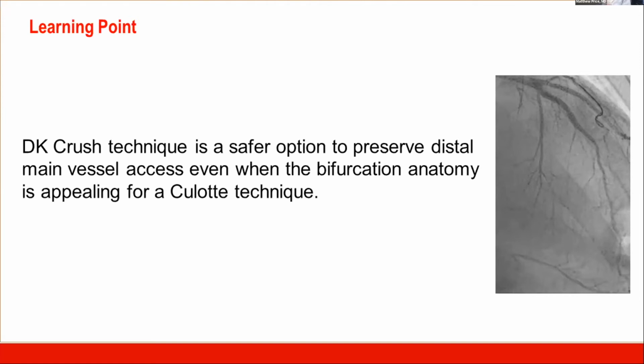Isn't that right, Richard? How many times you have a parallel overlap and you think you could do it by a wire, and when you OCT it's totally different. Yep. Until you become confident to listen to your imaging, if you believe in angiography and go by your angiogram and not imaging, you're going to get burnt because you'll be off by a couple of millimeters. The OCT tells you to the millimeter exactly where you need to be.